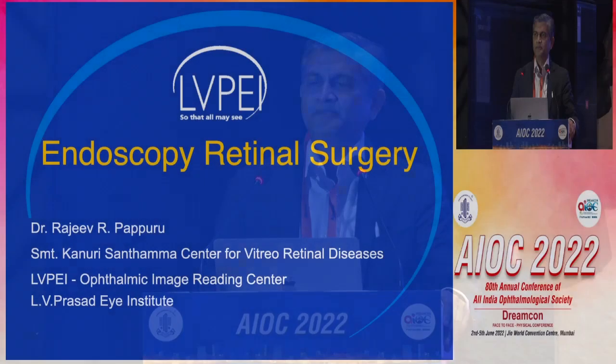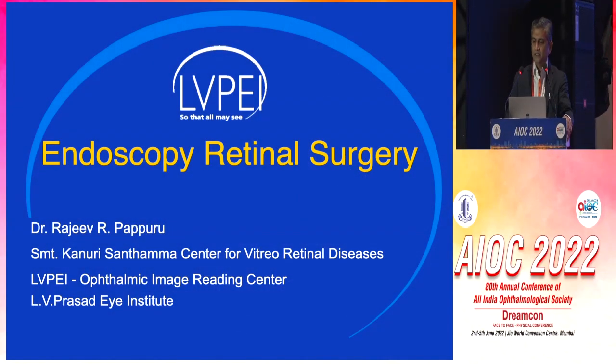Good afternoon, everyone. So we're going to start this session on instruction course on endoscopic vitrectomy. This session is important in a way because this is not the usual way of doing retinal surgery in our regular retinal practice. There is a different way of visualizing the retina, and this gives us another additional advantage of how to see the retina in cases where you can't.